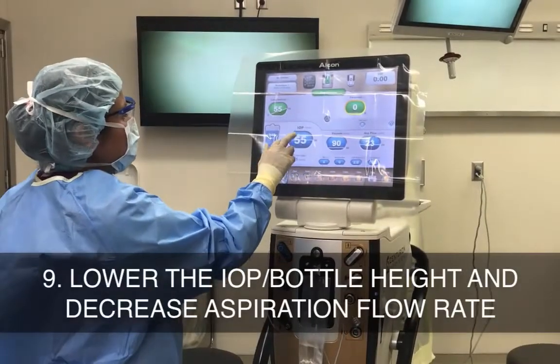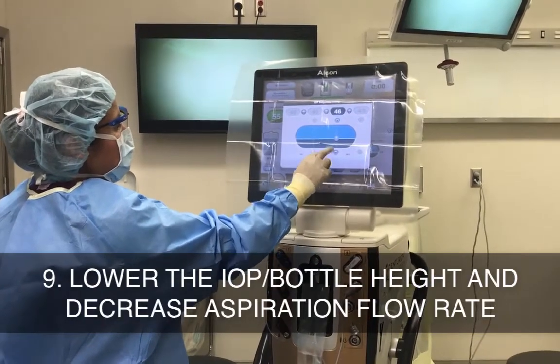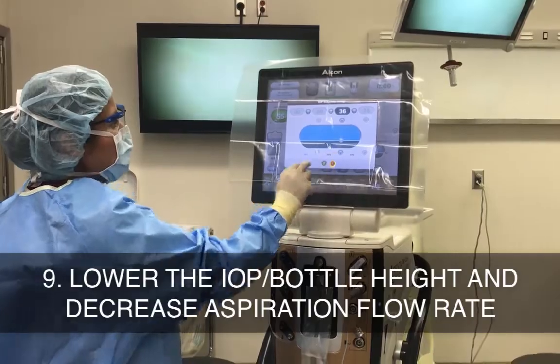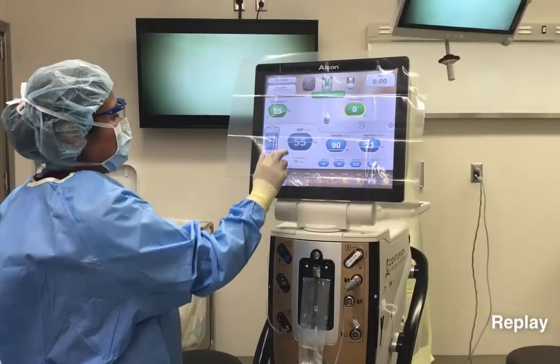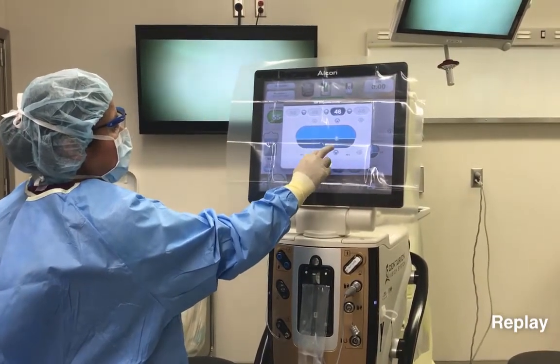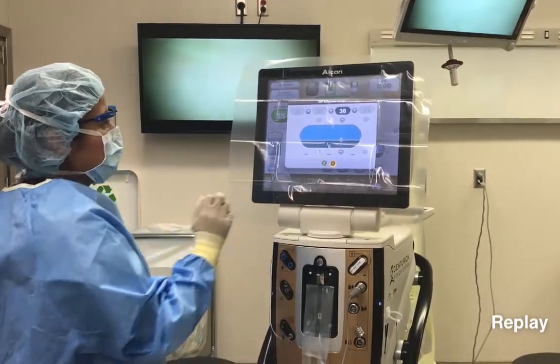Once you have successfully put the iris back into the eye, you should then be thinking about how to keep the iris from prolapsing again during the remainder of the case. One option, as you can see here, is to lower the intraocular pressure, or bottle height, and decrease the aspiration flow rate, which helps avoid large fluctuations in anterior chamber pressure and decreases the risk of repeat prolapse.